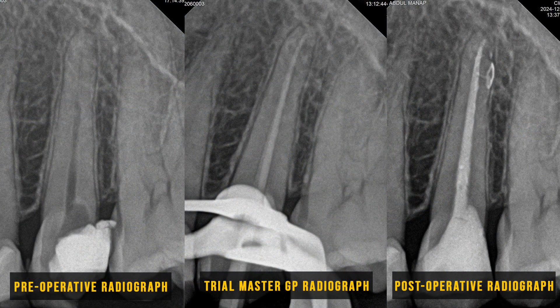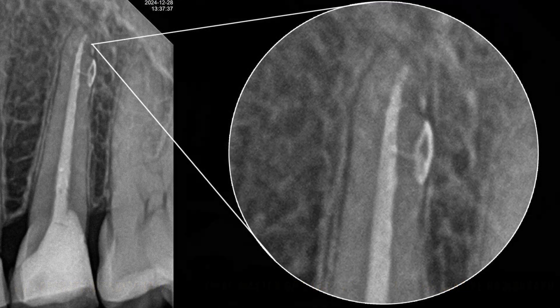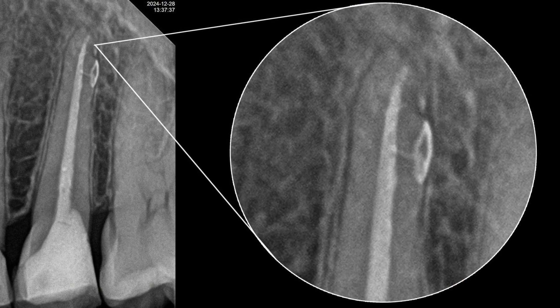Here's the post-treatment radiograph. Interestingly, the obturation unintentionally sealed lateral canals, which we can see clearly on the radiograph. This is a great example of how thorough cleaning, shaping, and obturation can address even hidden complexity within the root canal system.